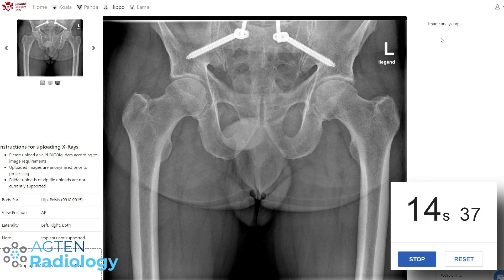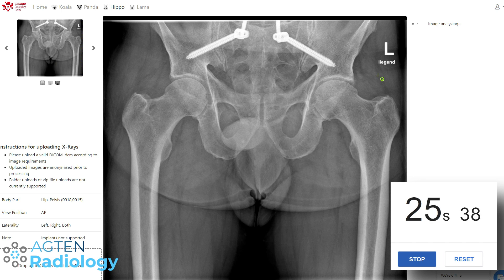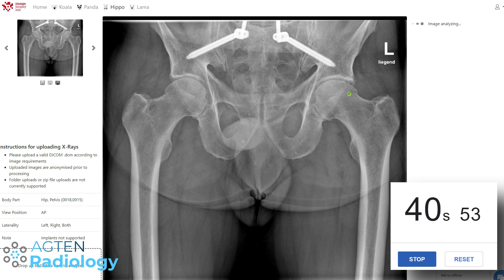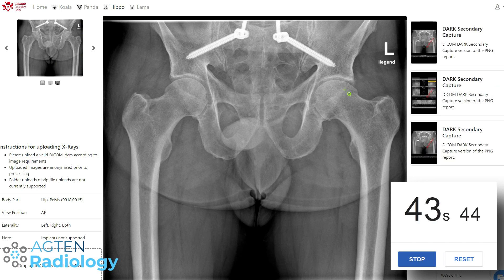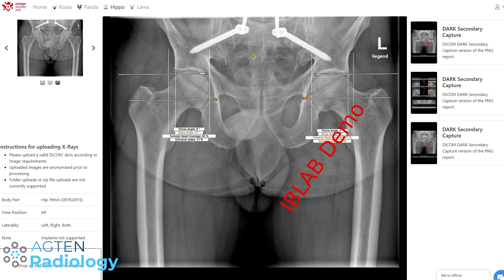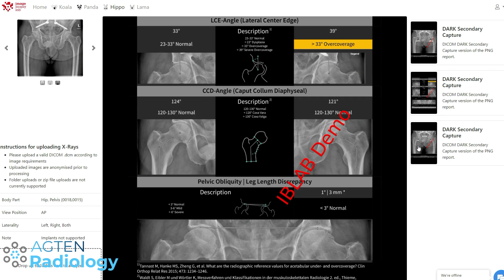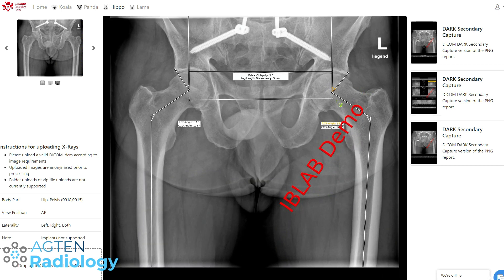What do you think about the speed? I think the speed is really impressive given that this is an online demo — we need to transfer the study to the server. It actually runs through the CPU, not the GPU — I asked them about it. That makes a lot of sense because the CNN for a radiograph is only one forward pass. This time we have a patient with some screws in the iliosacral joints, but it's still working — not interfering with the measurements. The angles look quite good here.